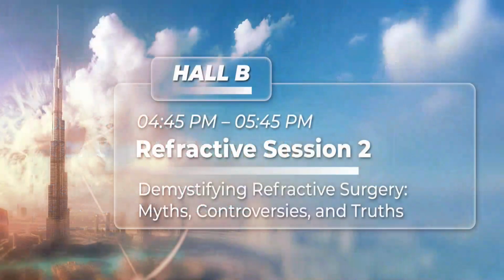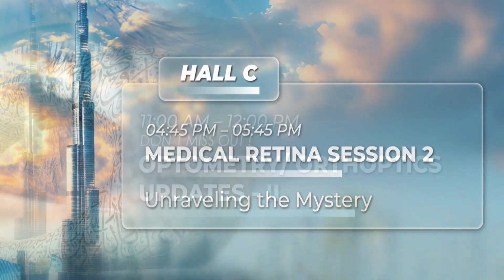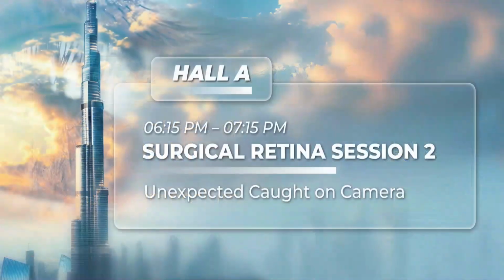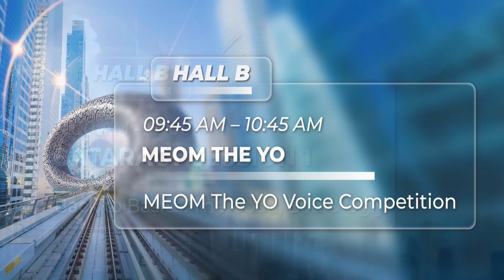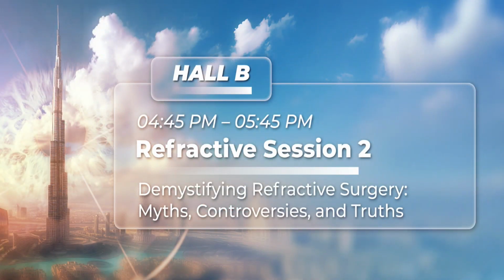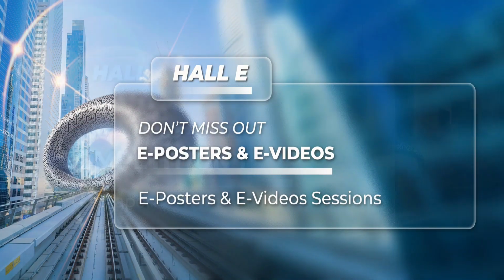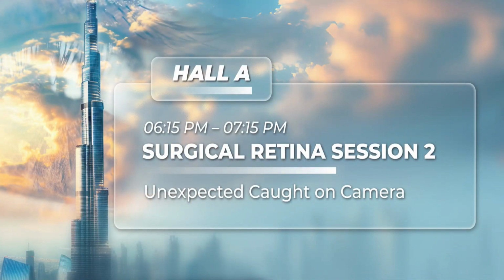Would there be any difference if the patient was like 13 years old, like you have more chance of progression, you would still choose to do the wavefront guided cross-linking or a regular one because it may progress further? No, because cross-linking only stabilizes the case. In patients with reduced vision, with visual symptoms and complaints, we aim to regularize the cornea to improve the corrected distance visual acuity. With cross-linking alone, you cannot improve the vision. You hopefully maintain it. But with this, you improve the vision, and we have seen here it improved the corrected distance from 0.4 to 1.